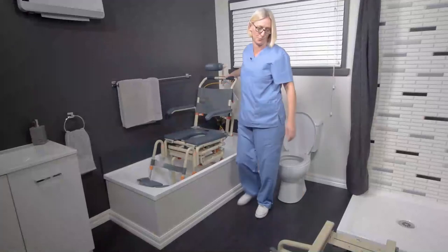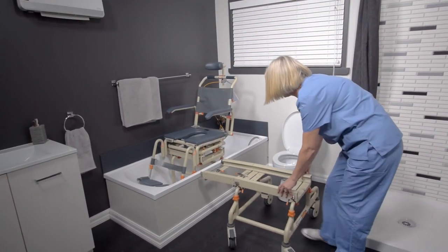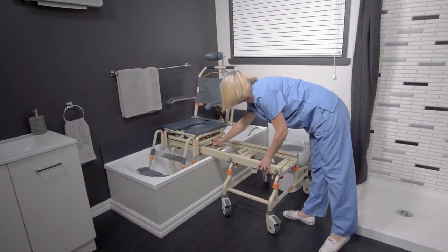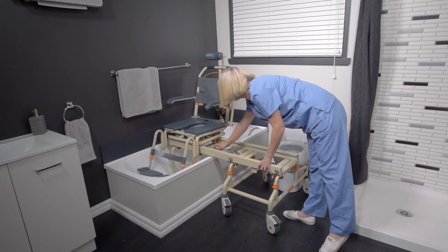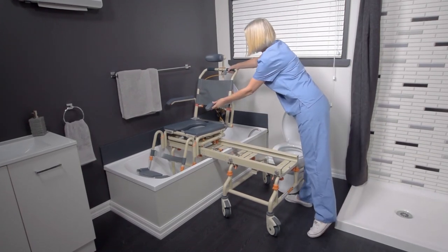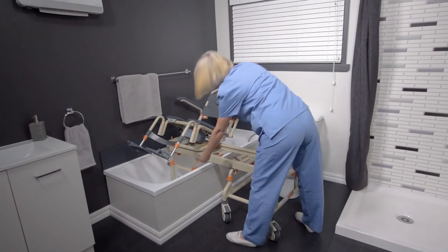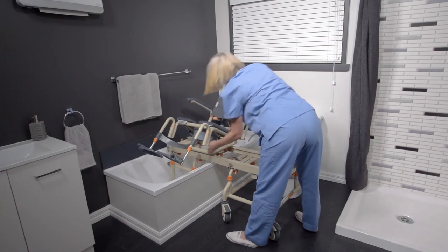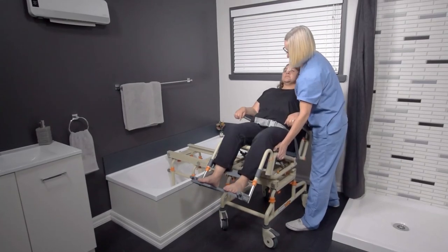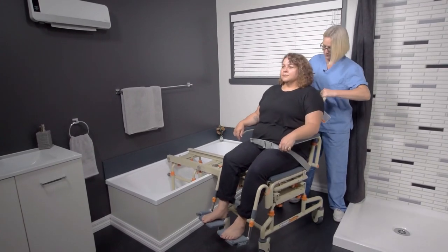Shower Buddy has allowed your client to again enjoy a private shower over their bathtub. In some installations you may find the bath is too high or too deep. We have accessories — height riser tubes for both parts — that will help in that situation. And if it's a tight bathroom, we have shorter bridges as accessories to reduce the footprint. You can also get a straight push handle, tension back rests, and cushion options for these chairs.